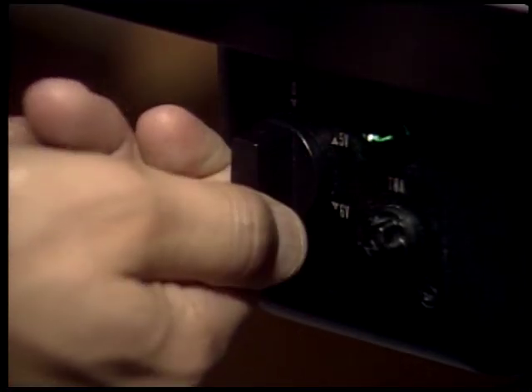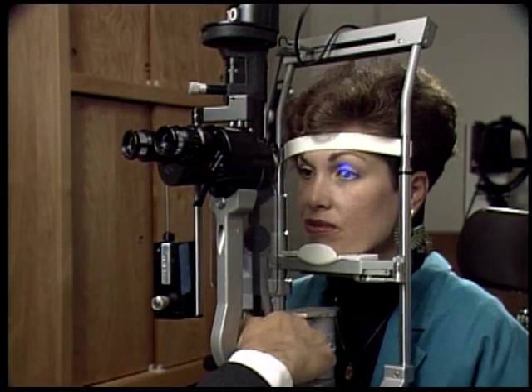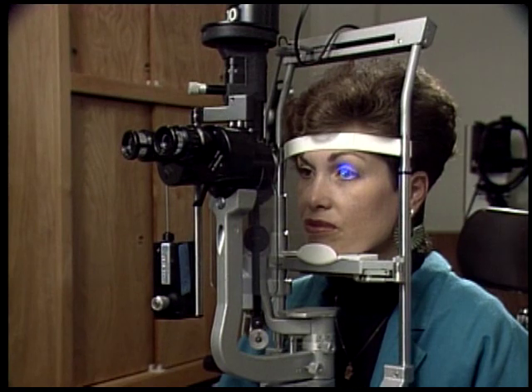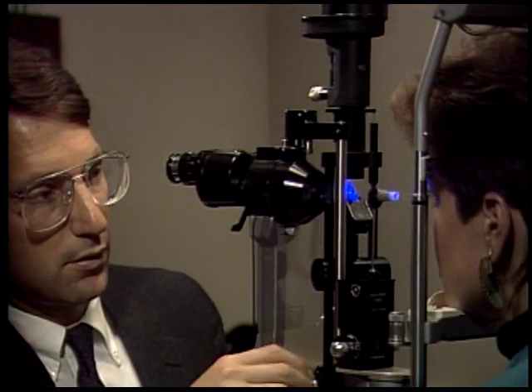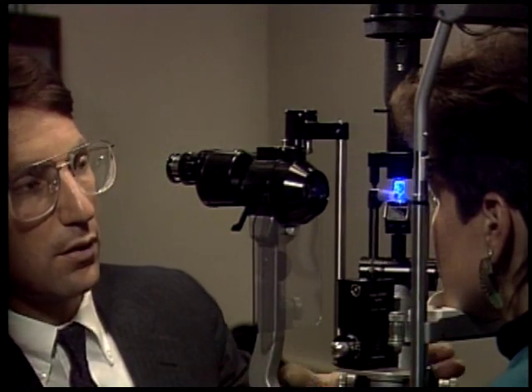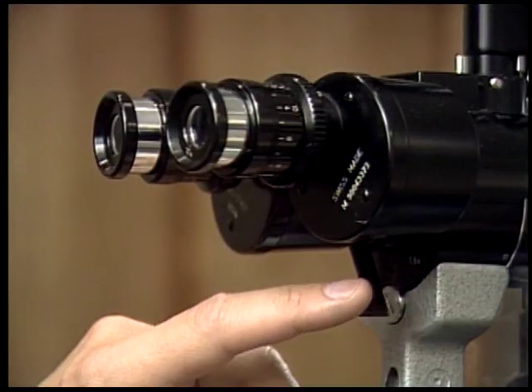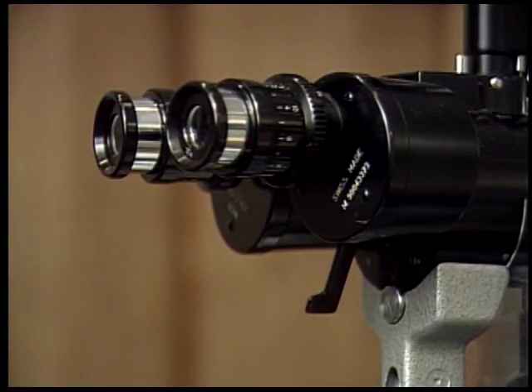After the slit lamp is turned on to its highest level of illumination, the cobalt blue filter is put into place, and the slit opened to its widest position to achieve the brightest light. The angle between the illumination device and the biomicroscope should be about 60 degrees to best illuminate the tip of the prism. Low magnification oculars are preferable.